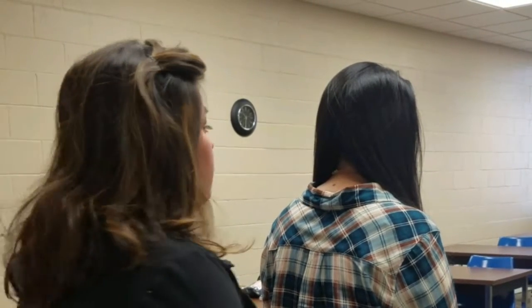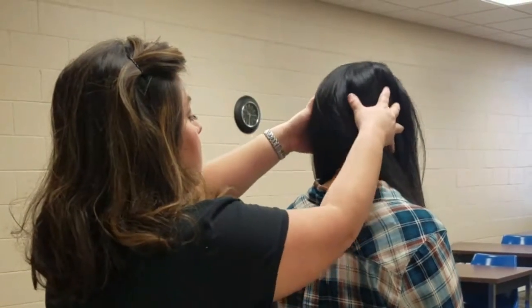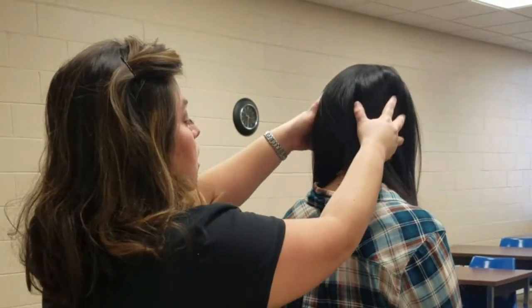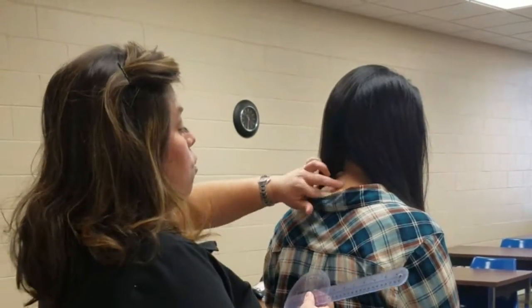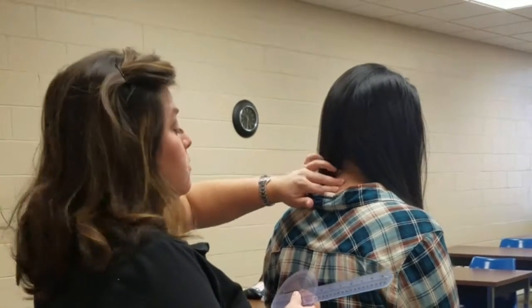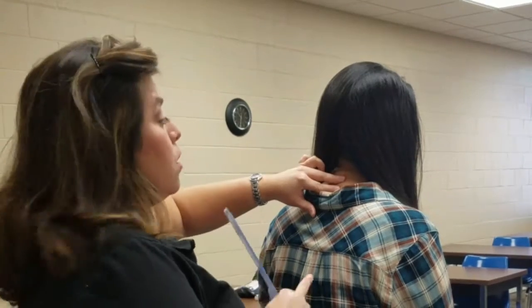All right, so now the measurements we're going to take are cervical lateral flexion. What we do is first I'm going to put her through the range. So we have lateral flexion to the left, lateral flexion to the right. We align the fulcrum of the goniometer over the C7 spinous process. And if it's hard to find, you can have them go into cervical flexion.